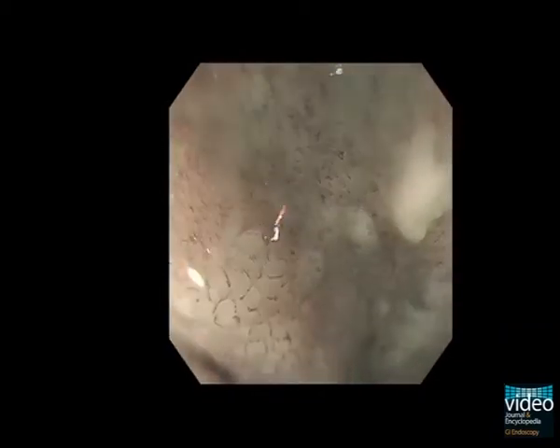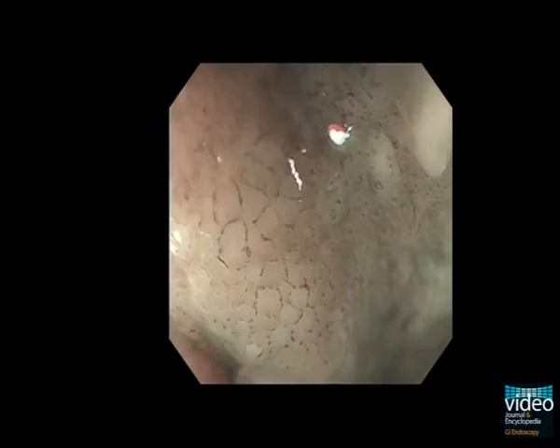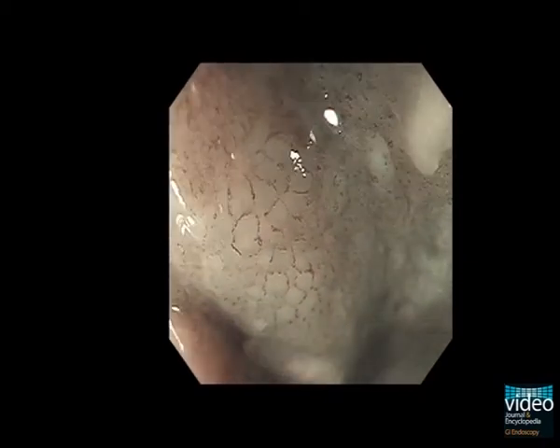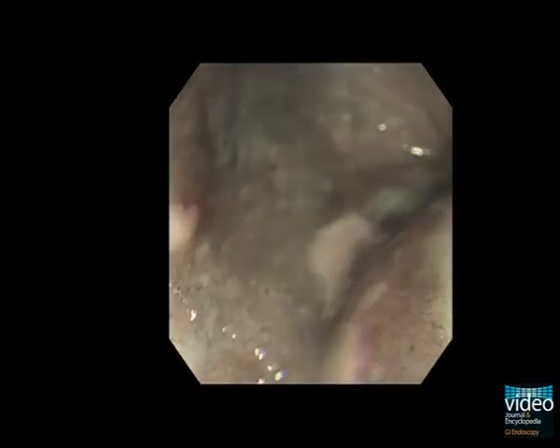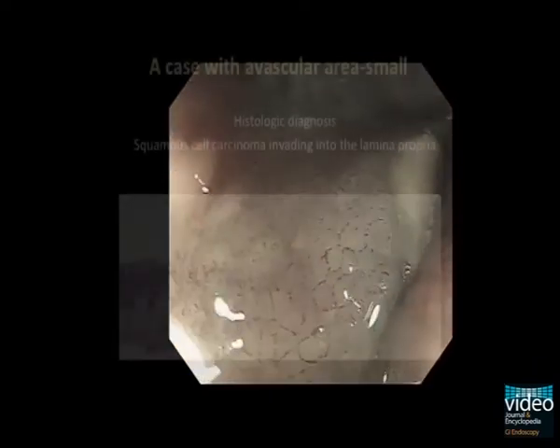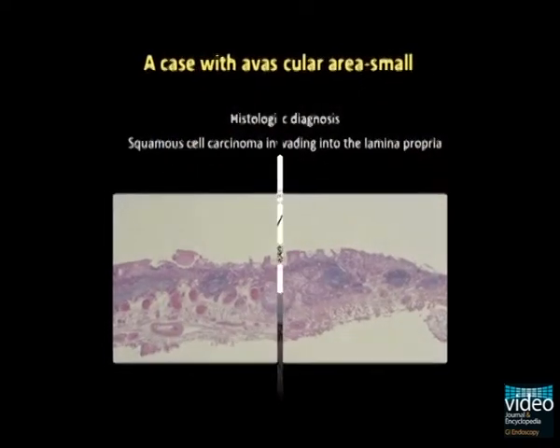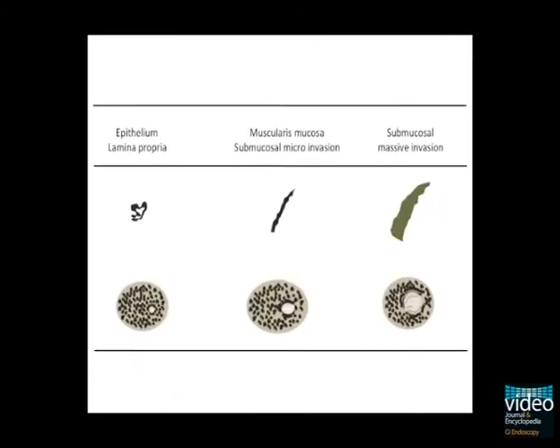Once we get closer to the lesion, we can see the honeycomb-like appearance, and at high magnification, many small avascular areas become apparent. The histologic diagnosis of the resected specimen was a cancer invading into the lamina propria.